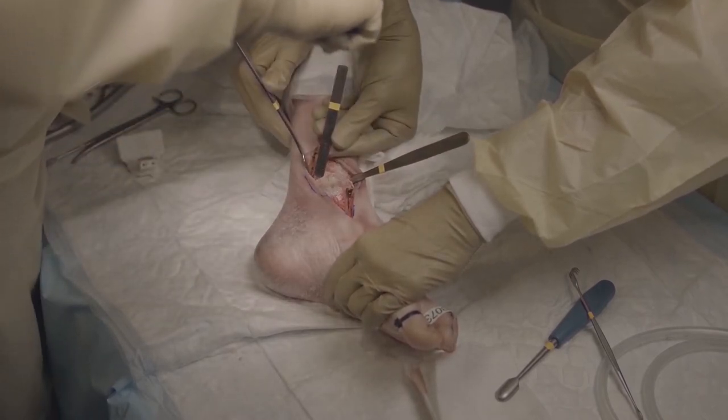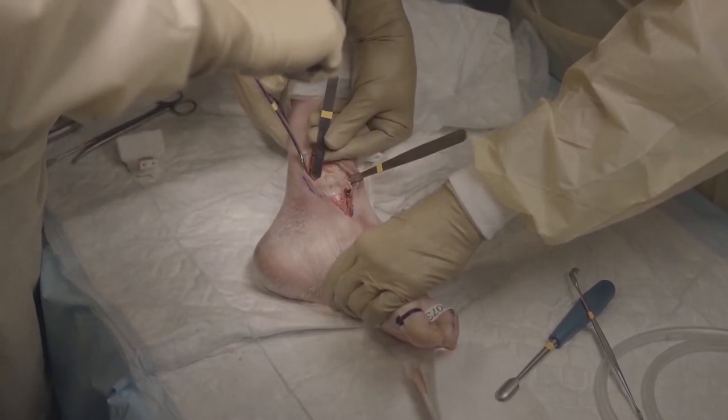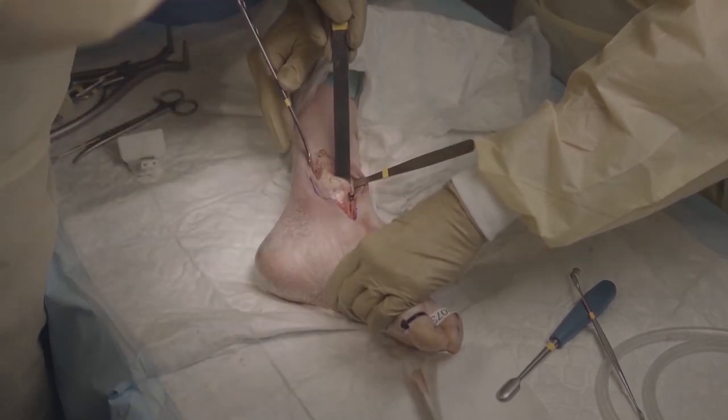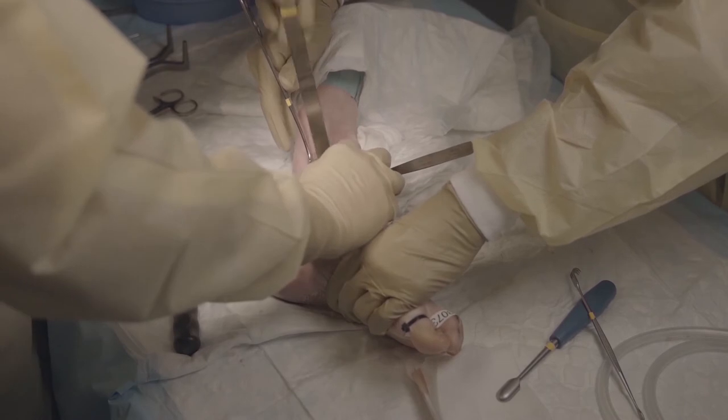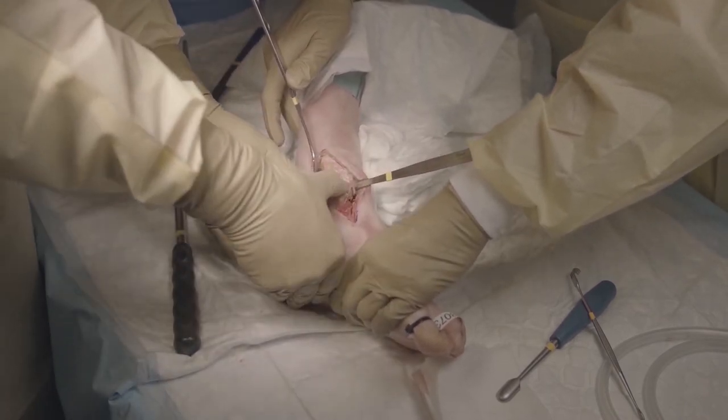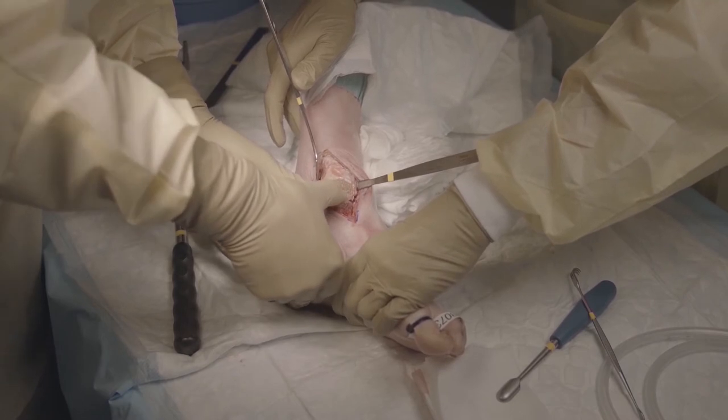After finishing the osteotomy we can flip the medial malleolus. We use a large osteotome initially and then with the two thumbs you will see that we can dislocate it.